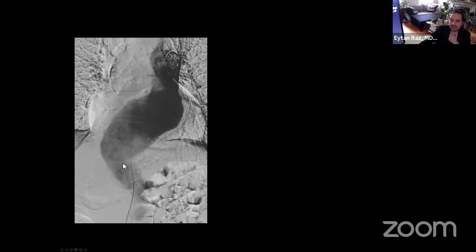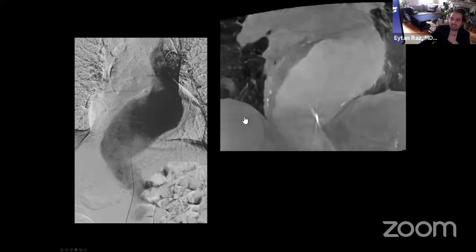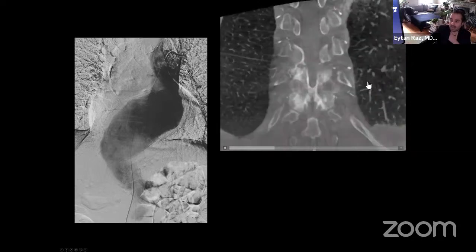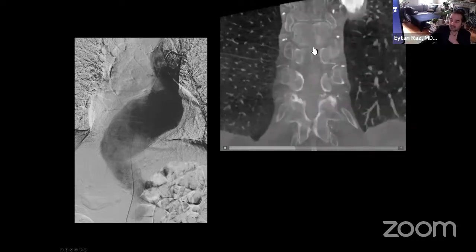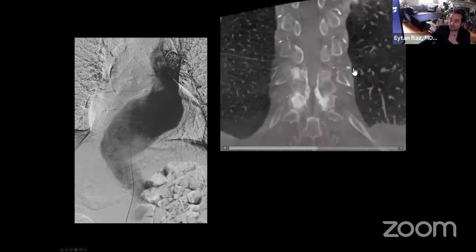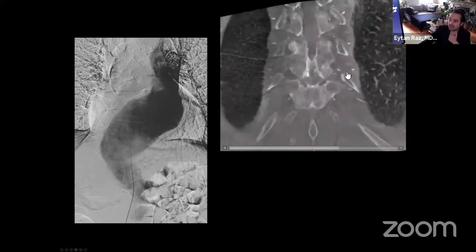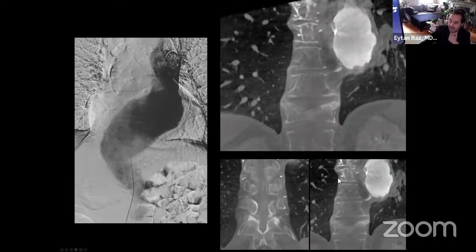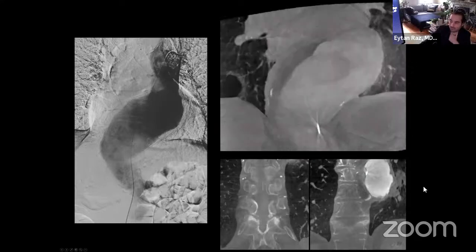Now, think about the nightmare of doing an angiography in a patient like this. Think of going through every single segmental artery in a patient with this aorta. One role is to do a huge, big DynaCT. You inject a lot of contrast, but with one injection you may have the answer that you want. And indeed, here you see the anterior spinal artery coming from here. So now you can follow the branch and understand exactly where the branch that supplies the anterior spinal artery comes from, and you can give a number to it, and provide very useful information.